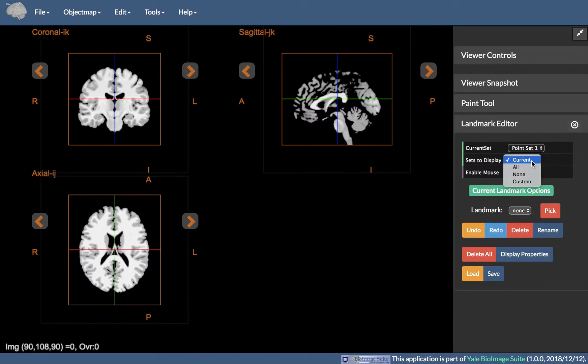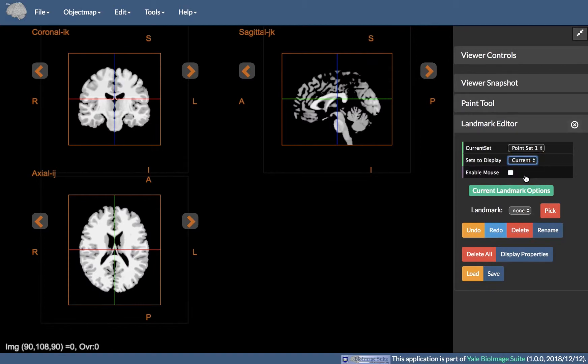Next is Sets to Display, which selects which point set to display in the viewer.